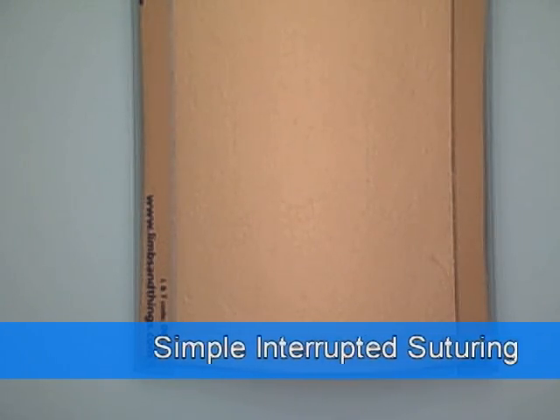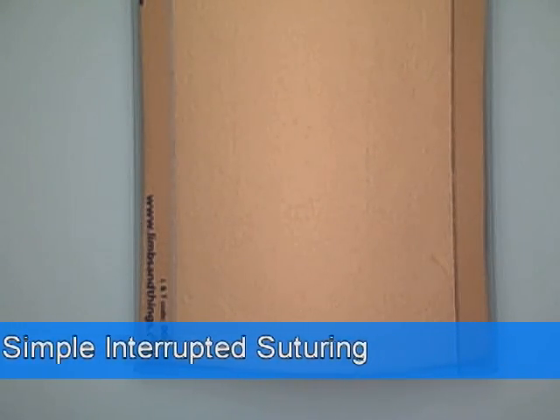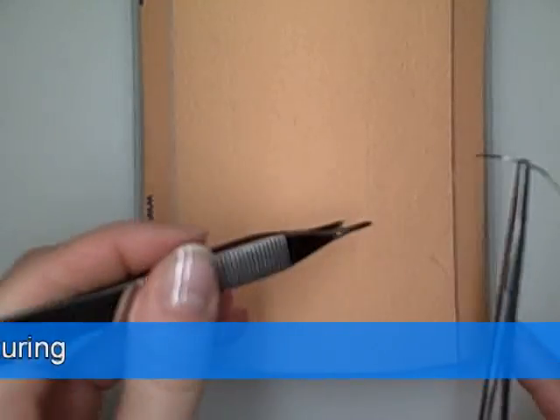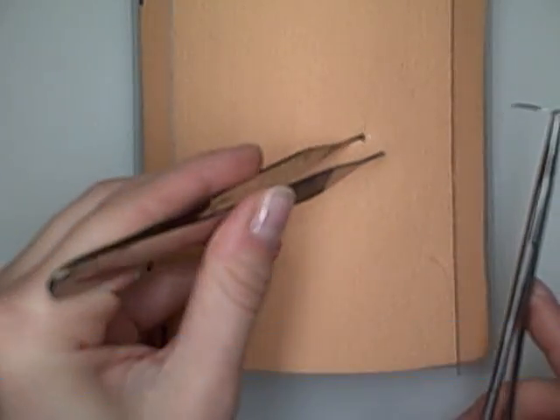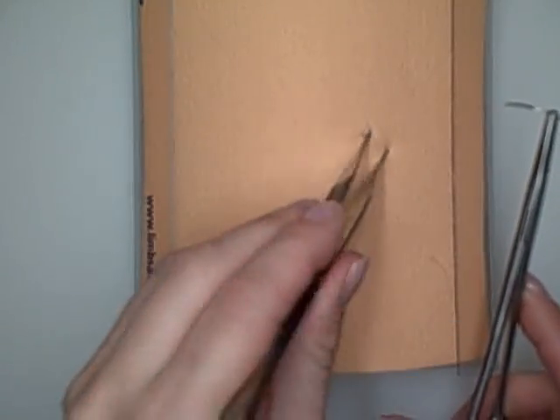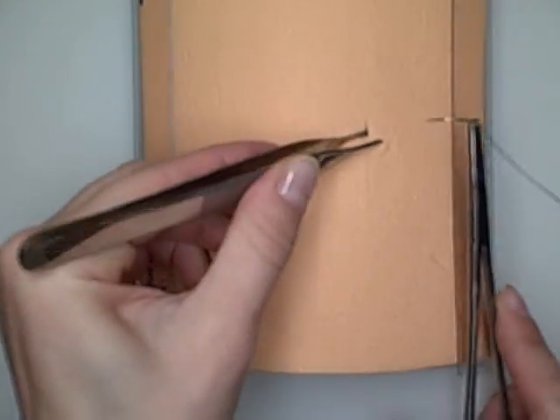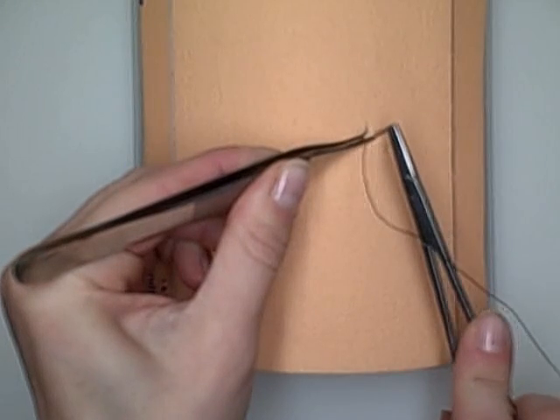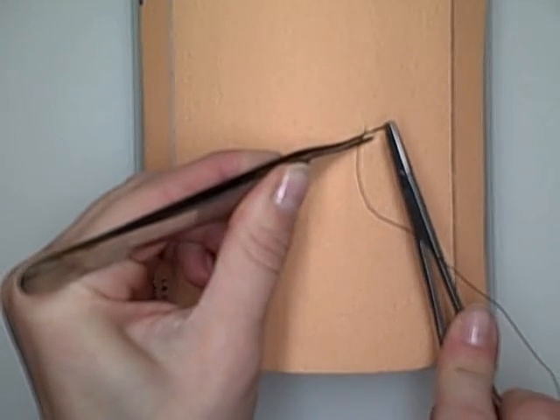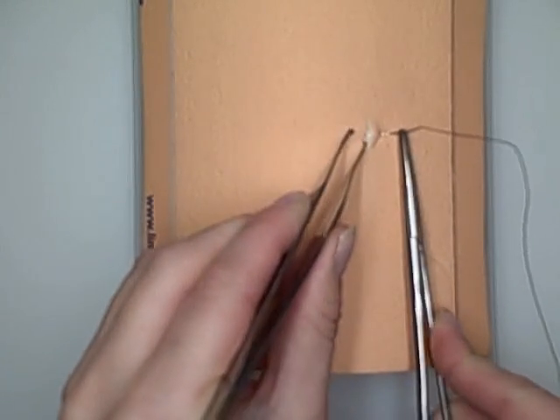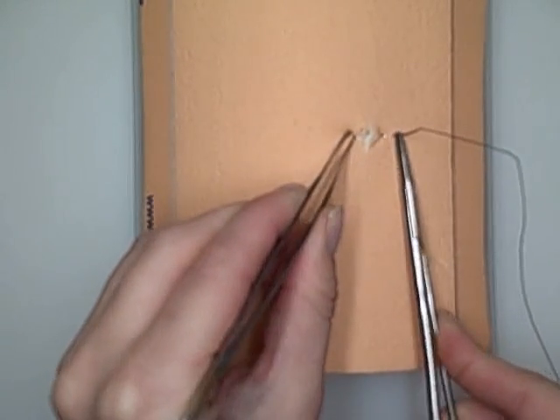So this is going to be an example of simple interrupted suturing, and this is something that you would typically do in the emergency room or the urgent care setting to repair a small, simple laceration.